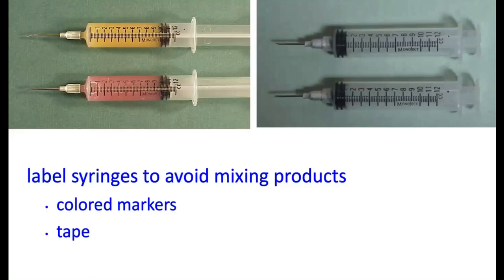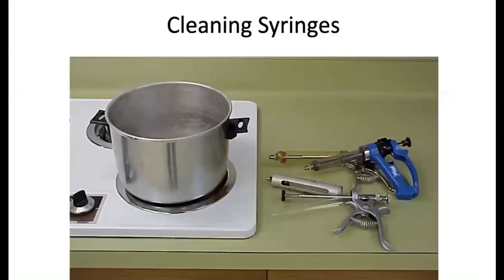The other thing with these plastic syringes is, let's take this 12 cc syringe here and say you were using a 2 cc vaccine. Well, theoretically, you could put 6 doses in there. The problem with trying to do that is it's very hard to make sure you give the same amount every time. So if you're using plastic syringes to give vaccine, only draw up 1 dose at a time. That's where those multiple dose syringes are really worth that investment. It'll make it a whole lot easier. Just go ahead and spend a little bit of money and do that rather than trying to use these incorrectly.